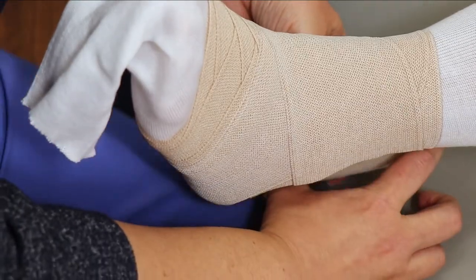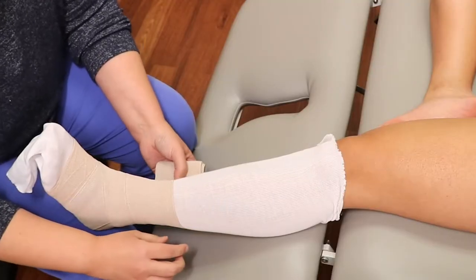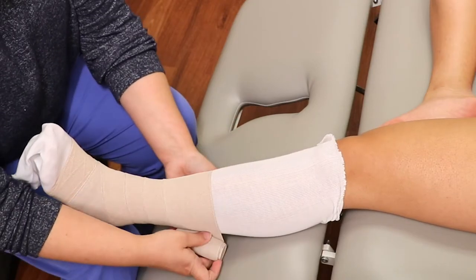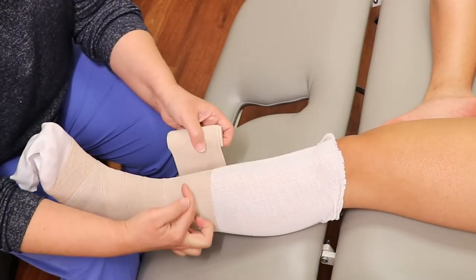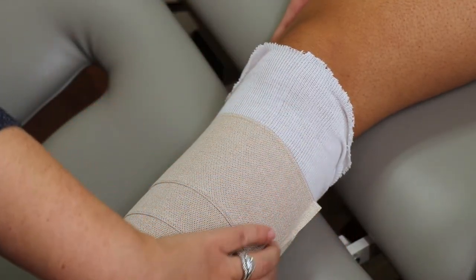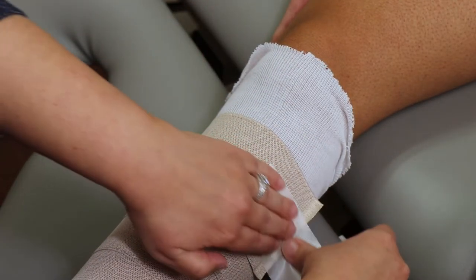Now continue straight up the leg overlapping each turn by half the width of the bandage. When you reach the end of the bandage, secure the end with tape.